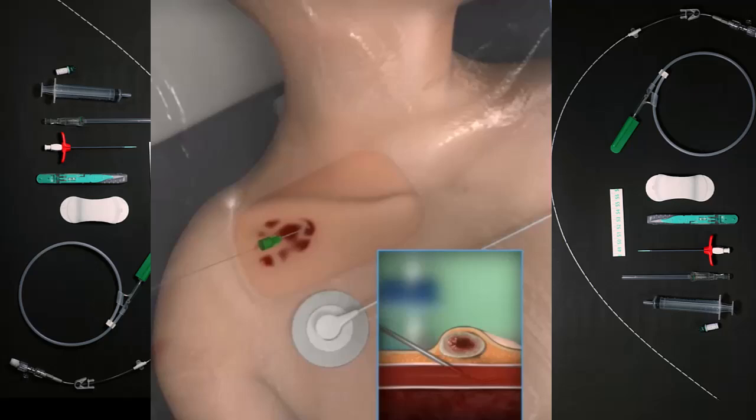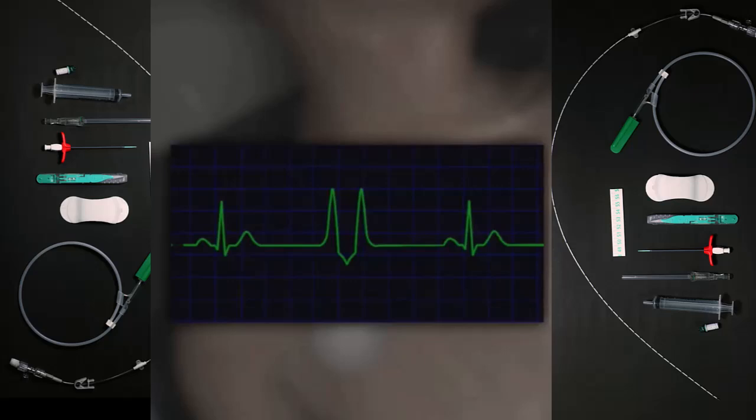Insert the guidewire into the needle and progress carefully into the subclavian vein. Stop the insertion of the guidewire when the EKG monitor shows an arrhythmia.